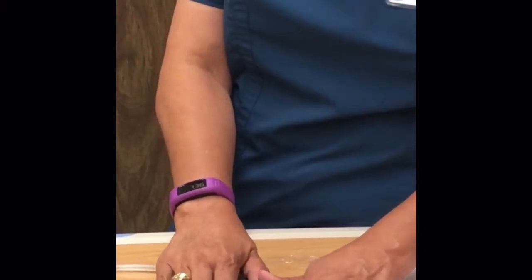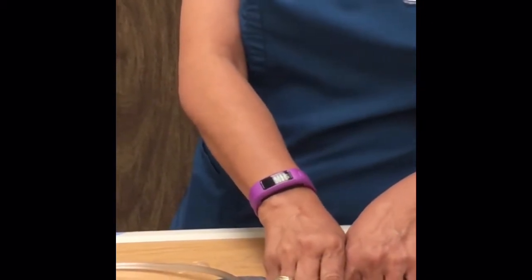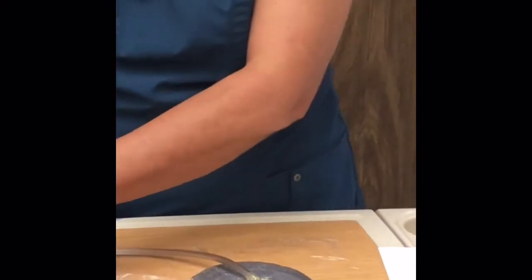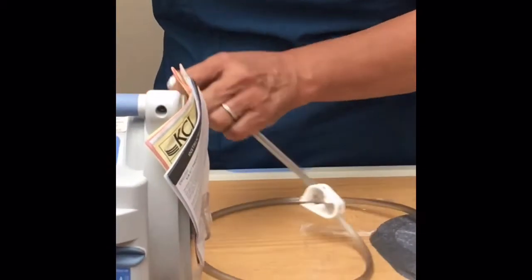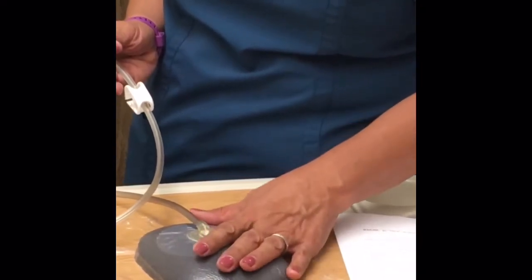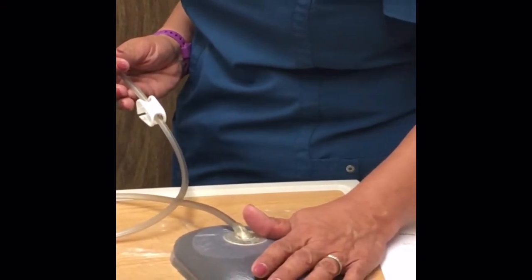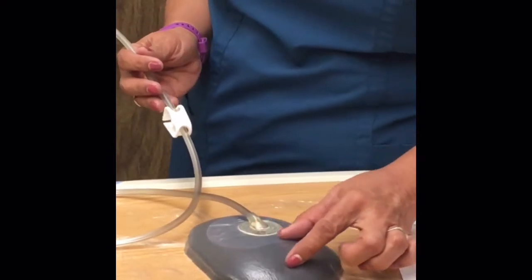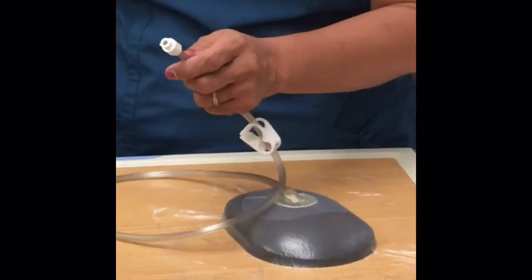If it's outwardly here and you find it along an edge, mark your spot. Have a pen, have a marker, mark it, okay? And then disconnect your unit, your hoses, so that you can have that sponge re-expand, because you are never going to be able to get drape to stick onto a raisin and cover that one hole, okay? So allow it to re-expand, cut a size of drape to fit, okay? And then place it down and reconnect and restart, okay?